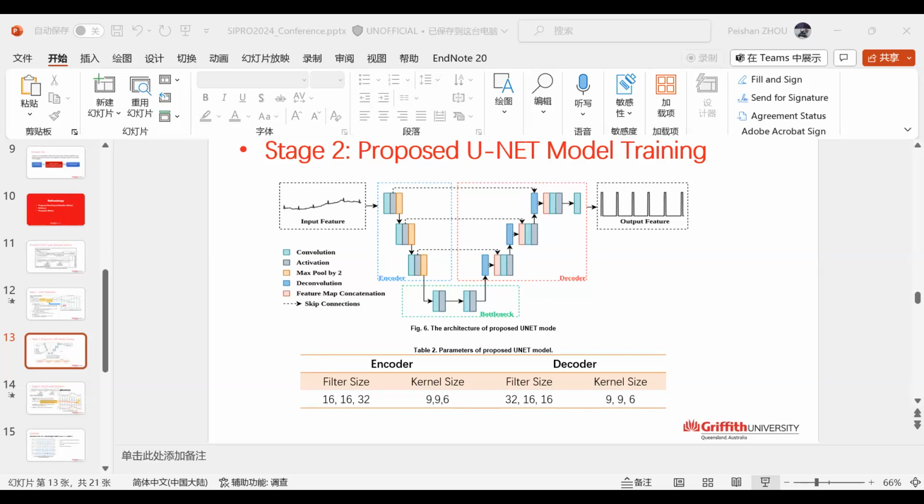So we trained the model for 400 epochs. We performed an inter-patient testing scheme and 5-fold cross-validation, which means the training data won't be seen in the test data. We also implemented 2 Pan-Tompkins-based baseline methods for comparison. It can be seen from the table that our proposed UNet achieves a perfect score of 100% for sensitivity, PPV, and also F1 score on 4 records.